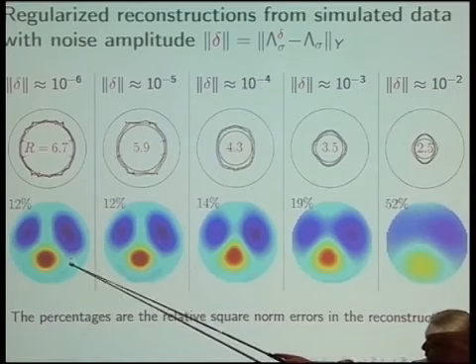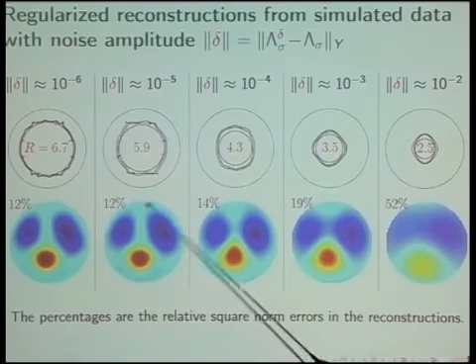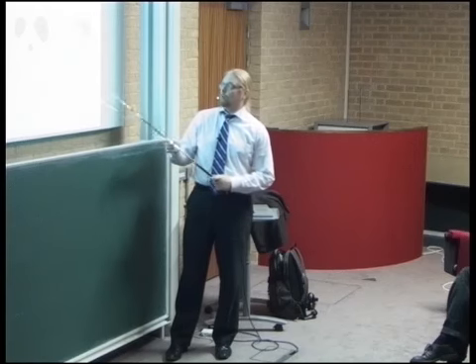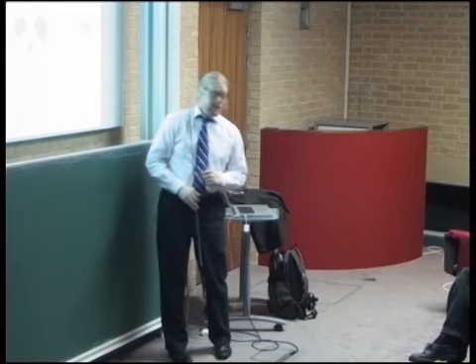And computed for you the reconstructions. You see this is the relative error in the reconstruction. So when the data is more noisy, of course, we start to get worse and worse reconstructions. And the effect is kind of a low-pass filtering, although it's actually a nonlinear effect, but still.